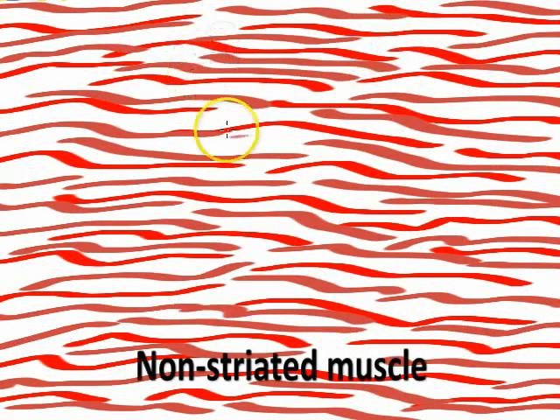Another big difference compared to skeletal and cardiac muscles is the lack of striations in these individual smooth muscle cells. The smooth name of the tissue is from the lack of these protein bands. In this micrograph of smooth muscle tissue, you can see the stacked, staggered layering of these individual cells. You can observe the skinny appearance of these cells, how they are running parallel to each other in these dense bands.